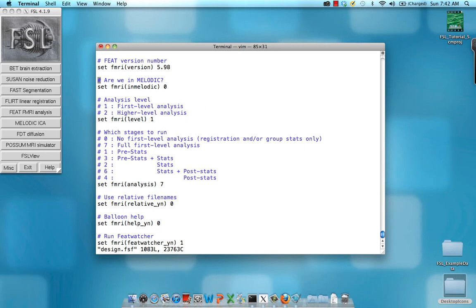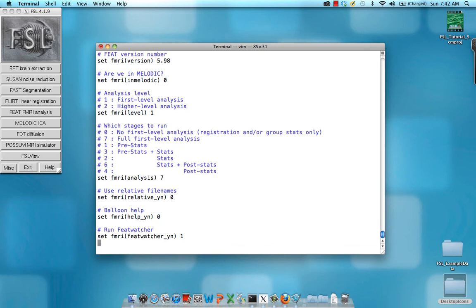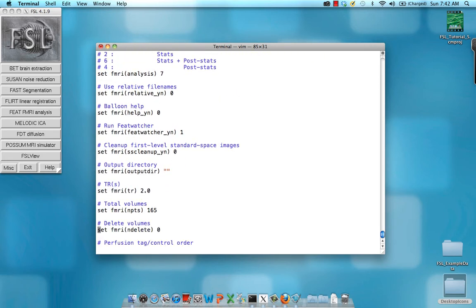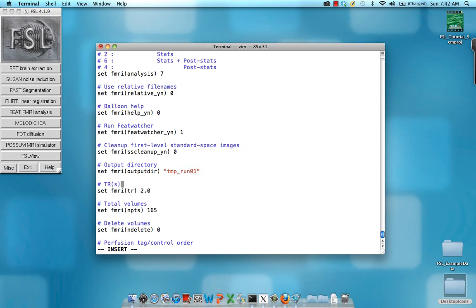Here you can see in text form everything that we filled in in the FSL GUI. All the options we wanted, for example, what stages we wanted to run, did we want balloon help, and what output directory did we want. I'm going to go ahead and just say temp underscore run 01 for now.